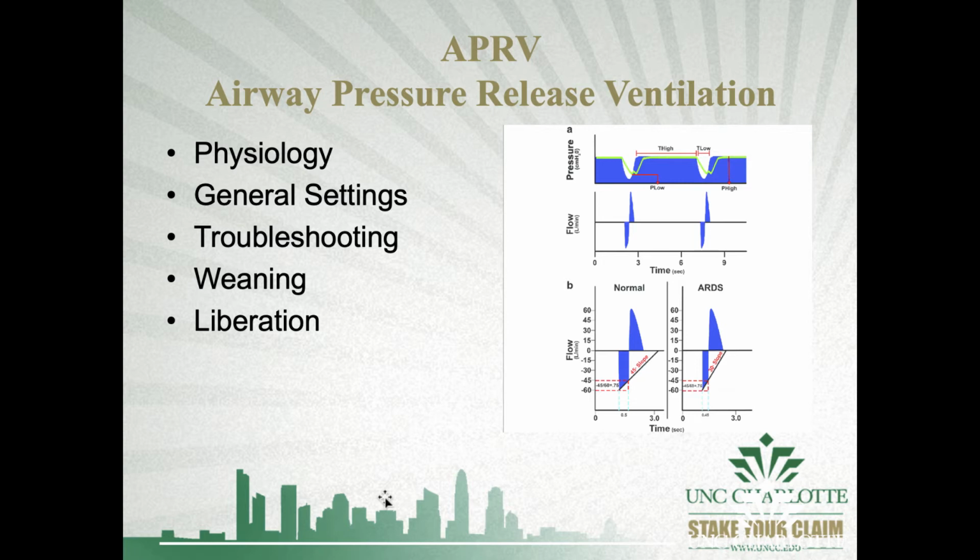Now we're going to set our times. We have two different times. We have a time high and a time low. Time high and time low are kind of iffy to set, but generally we're talking about initial general settings, right? You just got a patient, you're going to throw them on the ventilator. We're going to set our time high at 5 seconds, okay? And we're going to set our time low at 0.5 seconds.